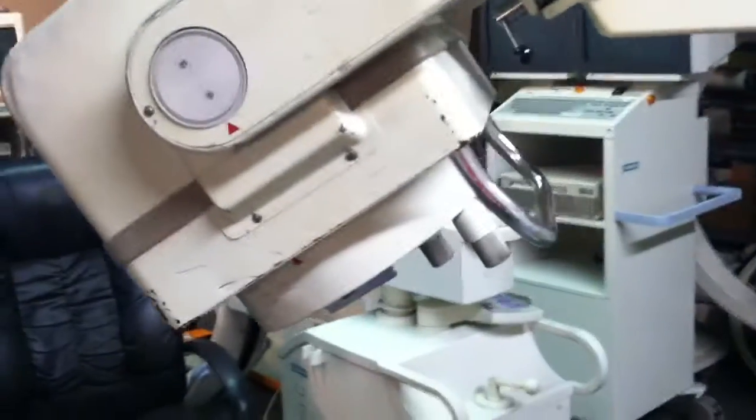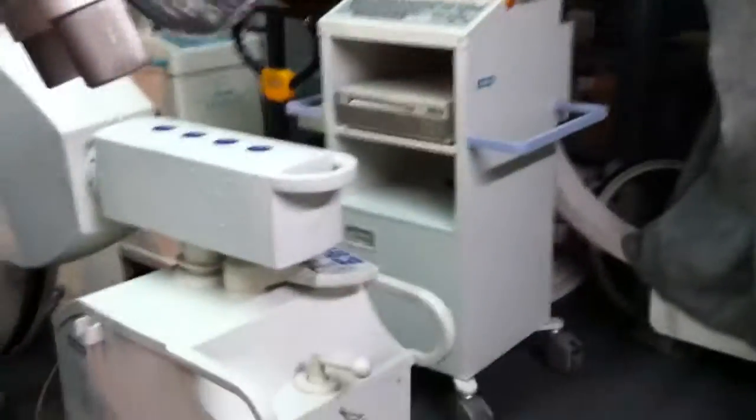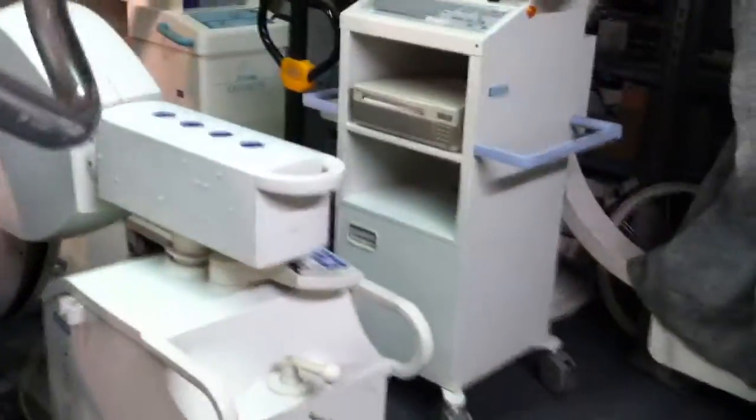Everything moves right. Everything works. Locks in here, like so.